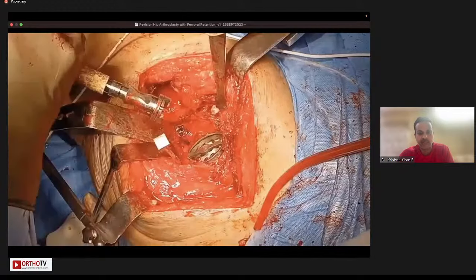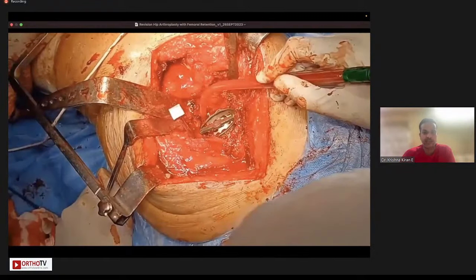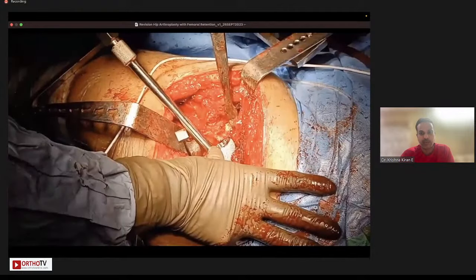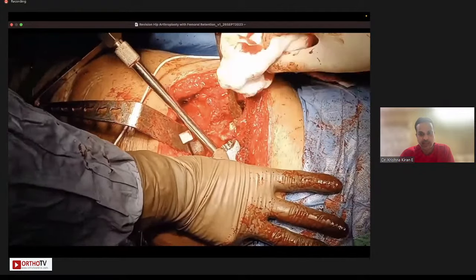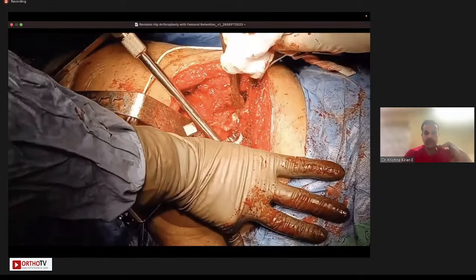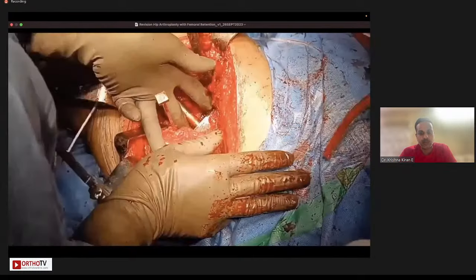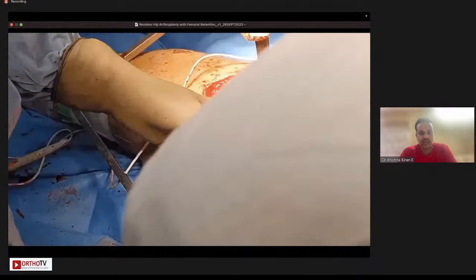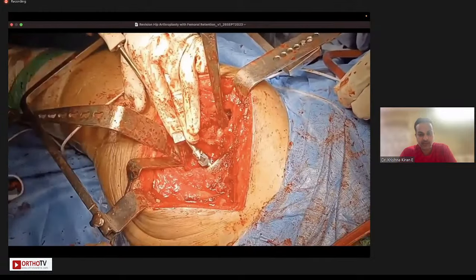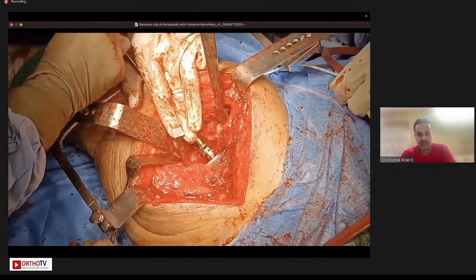You ream in reverse, and wherever the reamer disengages, that is the size of the socket. So there is the AP capture which has happened for that particular cup. In these situations, typically we use highly porous materials like trabecular metal or gription or stick-tight coated, which are multi-hole, typically to allow us to get more screw fixation. And it is always a good idea to put 2 or 3 screws in multiple planes in order to secure the acetabular component positioning.